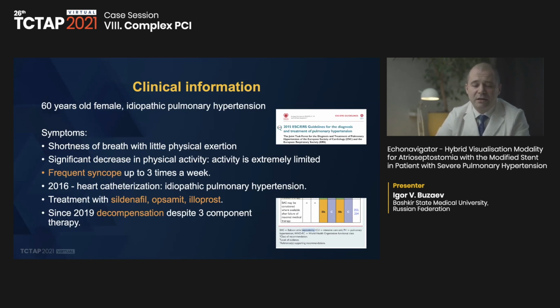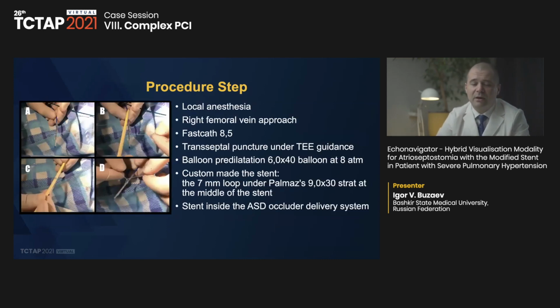and we did the operation under local anesthesia with a fast-cut sheath. We took the 8.5 sheath, and we used it to make a transseptal puncture under transesophageal guidance.